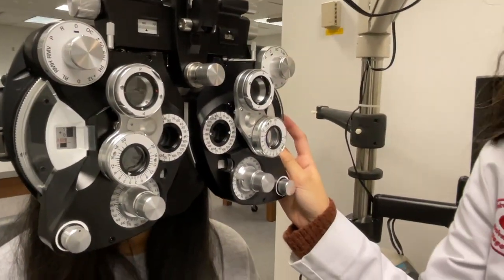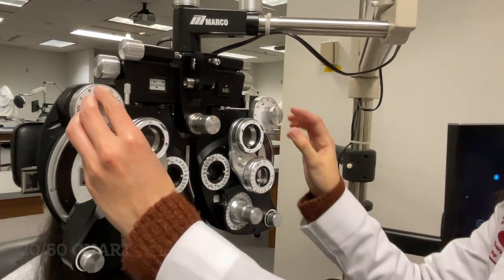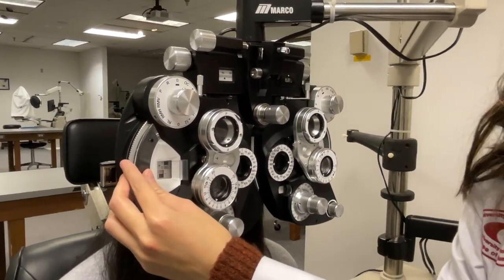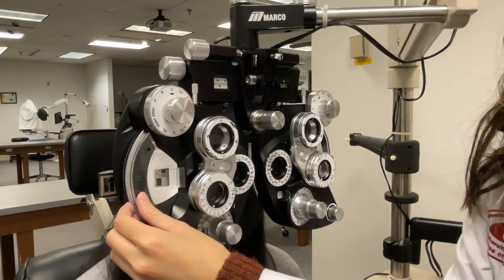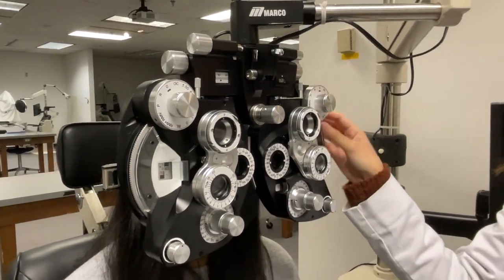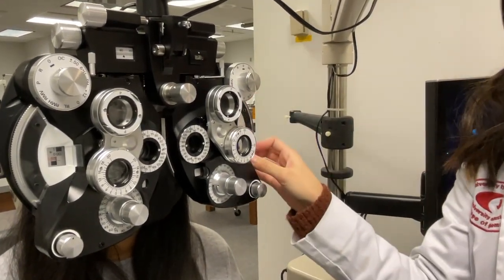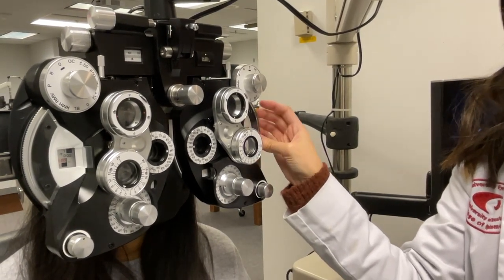Mrs. Lee, what's the lowest line you can see? TZVECL. Good, and then right here, what's the lowest line you can see? TZVECL. And then right here, what's the lowest line? OFLCT. Good. And then right here, what is the lowest line you can see? TZVECL. And then what about here? APEOTF. Good.